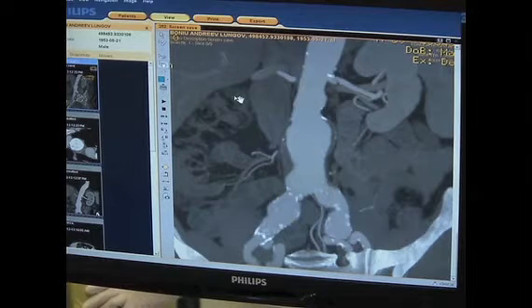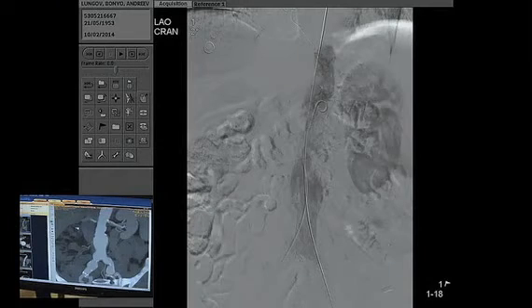With the help of Dr. Concha, who is our proctor about the Medtronic device, we decided that the case is suitable for the Medtronic Endurant system. We have a pigtail from above, a pigtail from the radial artery, to have comfortable angiography from above, in order not to change anything on the level of the femoral arteries, just to handle devices.